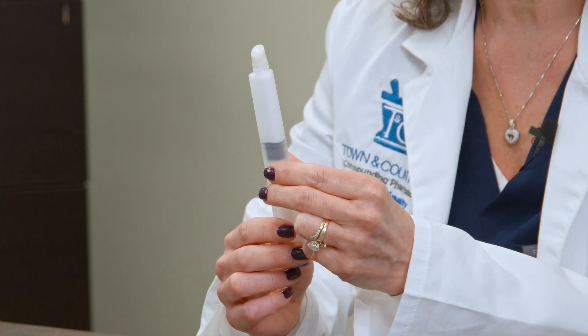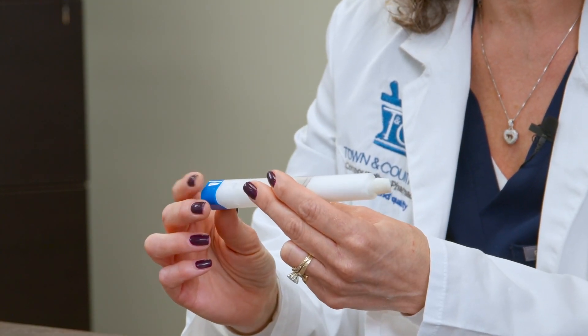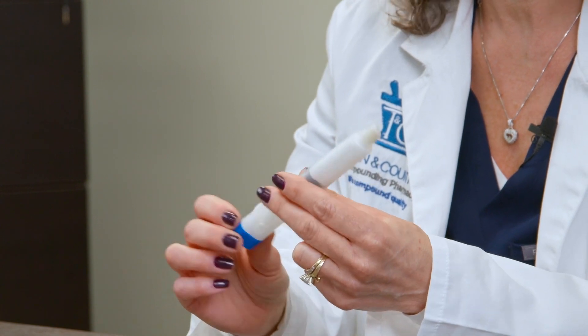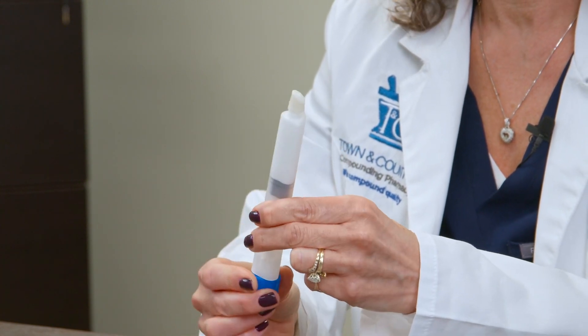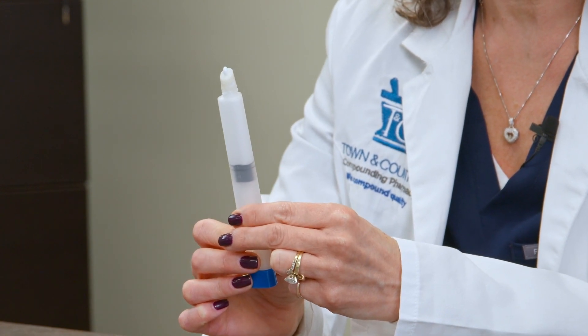On your particular prescription, there will be a label that indicates how many clicks you're to apply each time you use the medication. When you get your device, make sure the cream is even at the top, and then go ahead and turn the bottom end the amount of clicks that your prescription indicates. We're going to use one click. As you can see, one click is a very small amount of medication. People get alarmed sometimes that they're not getting the proper dose — it is your proper dose. It's very potent in the small amount of cream.